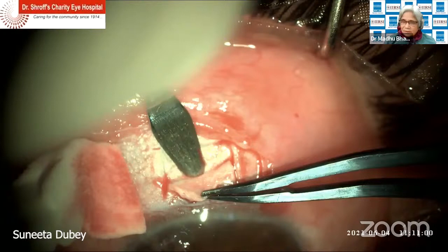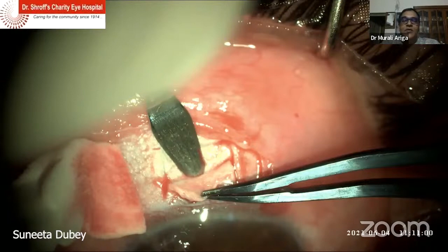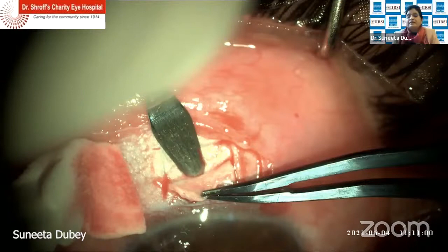But yes, for the depth, this BP knife is the best thing to judge the depth. I think there's only one point. And also the 15 blade. Anything else to add?